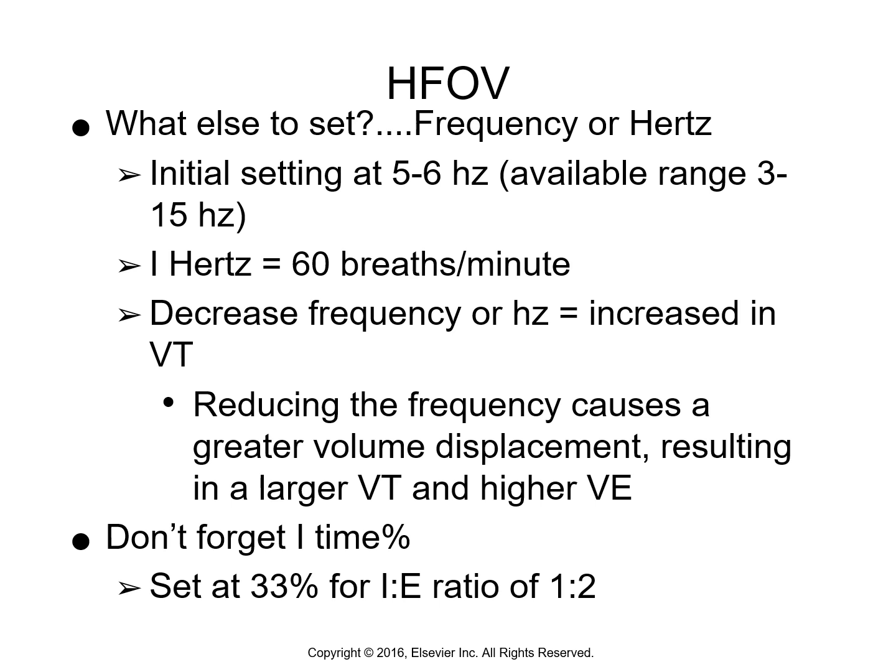So the other thing we need to set is the frequency or the hertz, okay? So you have to keep in mind that 1 hertz is equal to 60 breaths per minute, okay? So your initial settings then are about 5 to 6 hertz. So what is that? About 300 to 360 breaths per minute.